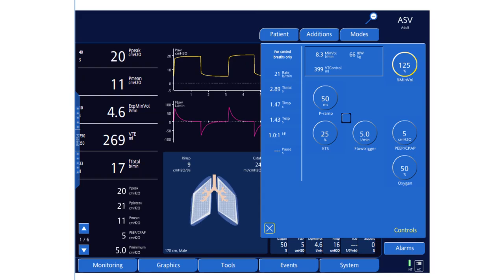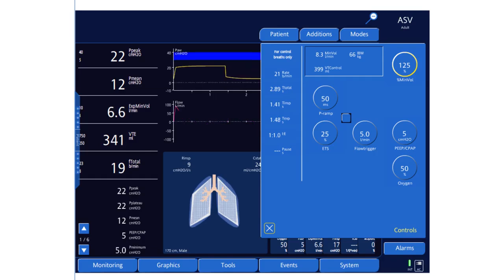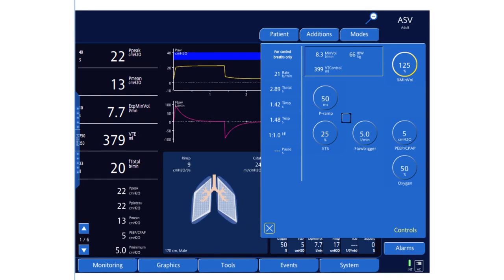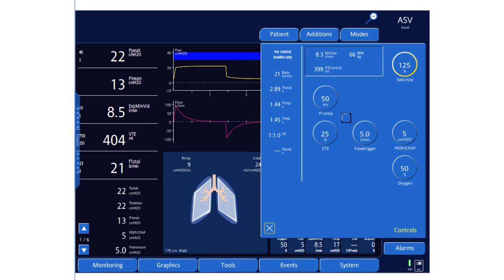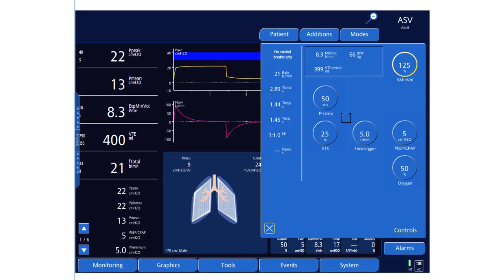In patients with fever, you need to increase the minute ventilation by at least 10%. Then you set the Pmax. This simulator does not have the Pmax dial, but you can see it here already set at 40. If you set it at 40, the limit would be 10 centimeters below that alarm limit. So be careful — with an ARDS patient, do not set the alarm limit too low. If you set it at 30, the pressure will not go above 20 cmH₂O. Setting it at 40 will limit pressure to 30 cmH₂O, keeping within a protective lung strategy.